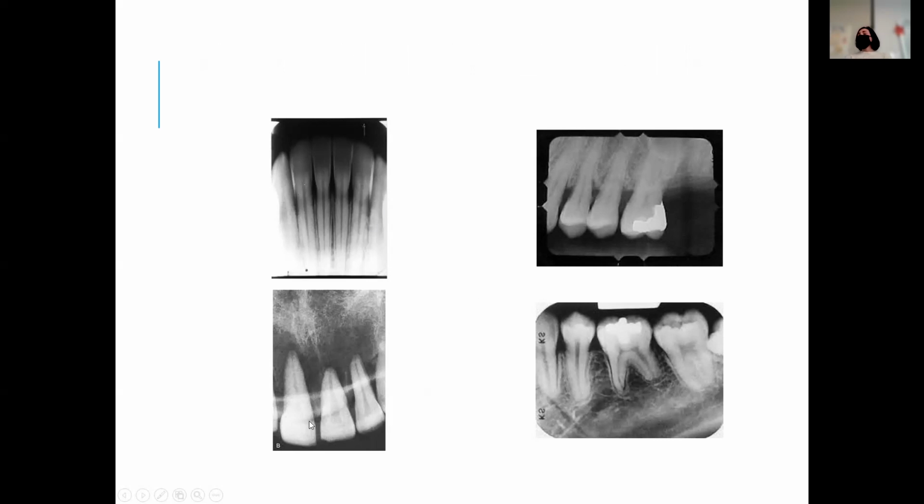Something like this, does this look foreshortened or elongated? And that's a little more obvious too, right? Everything just looks blunted, and it just seems like the angle, instead of coming at the facial surface, almost came underneath a little bit and was looking more directly on the incisal edge, as opposed to coming more perpendicular to the teeth. So here, these look a little stretched out to me as well. And then this one also, you can see more occlusal surface and things look short. Now, I think their roots are short anyways. So I think there's two things happening, but they definitely did foreshorten it. There is some foreshortening here.